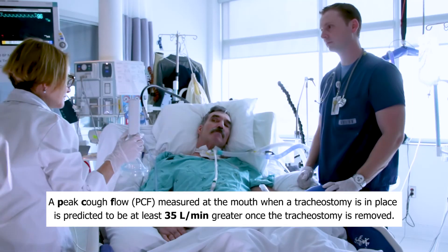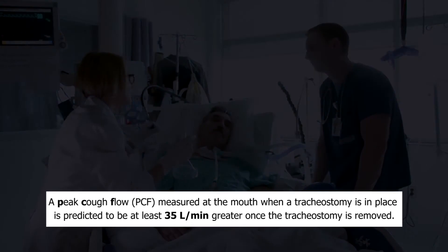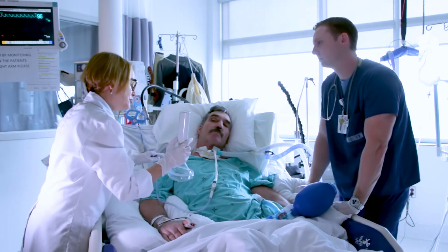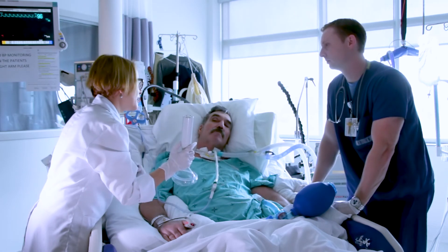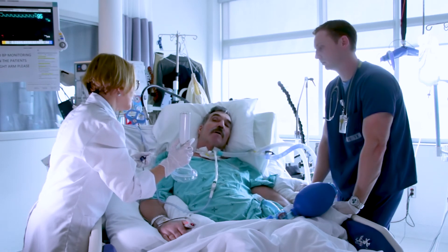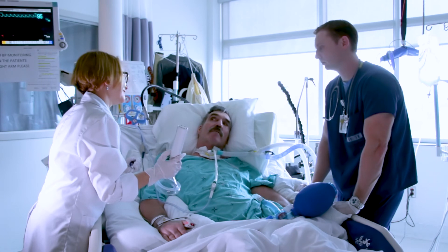So if we were to remove the tracheostomy tomorrow, we can estimate that your peak cough flow would be close to 200. You need 160 in order to move secretions. Now, I have worked with individuals with the same level of injury, and once the trache is out and they're used to doing this, the peak cough flow can rise to 400. Once the tracheostomy is out, you can use lung volume recruitment with a bag, lung volume recruitment with a ventilator, or glossopharyngeal breathing in order to expand your lungs and cough just like anybody else. That would be very handy — that would be great.